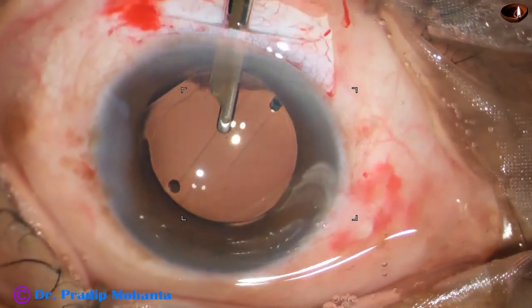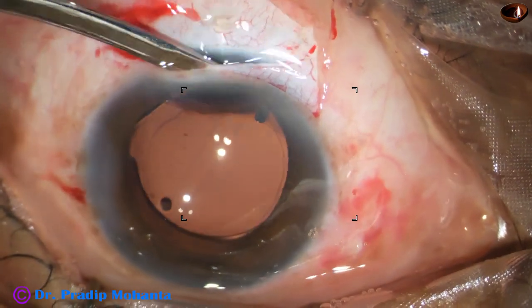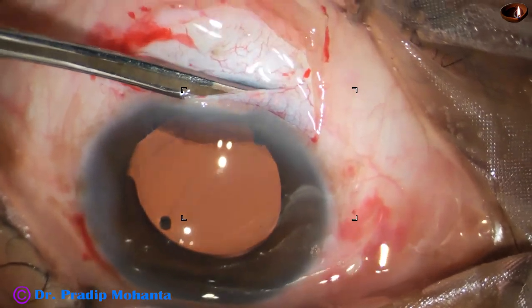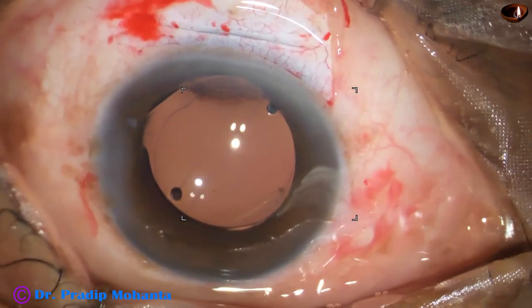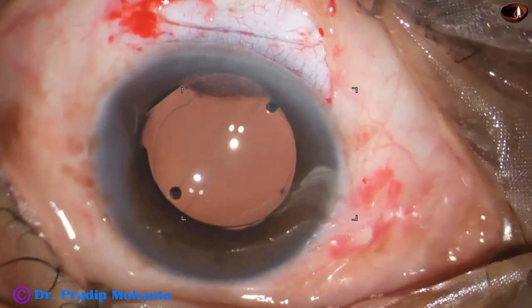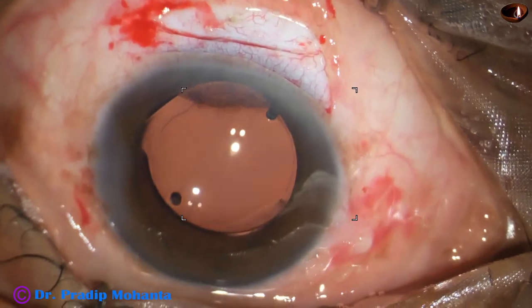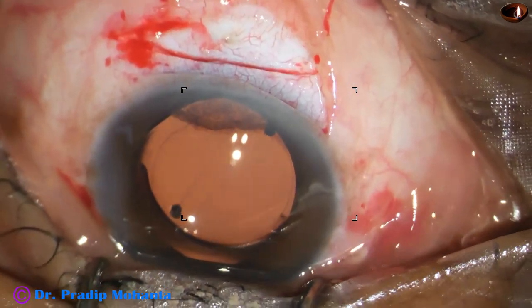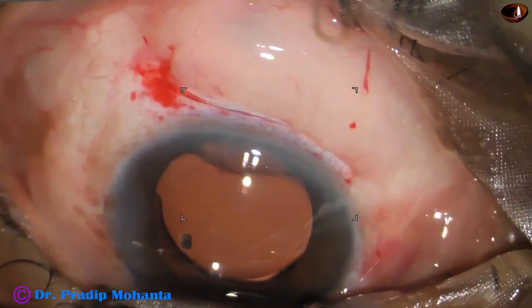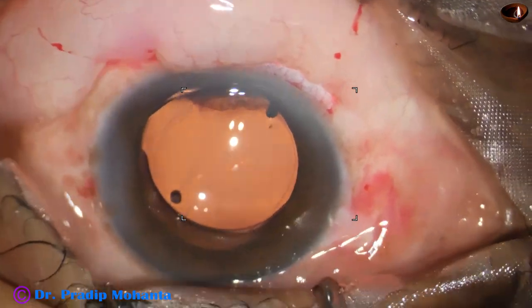This is the final lavage of the anterior chamber. The anterior chamber is formed very nicely. The wound is checked with a cotton-tipped applicator — no leakage, intraocular pressure is okay. The conjunctiva has to be opposed to the limbus. No suture is used; instead, subconjunctival gentamicin and dexamethasone are injected, creating some chemosis, which will push the conjunctiva to the limbus.